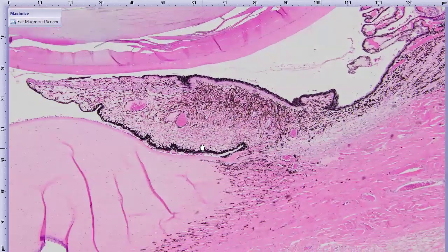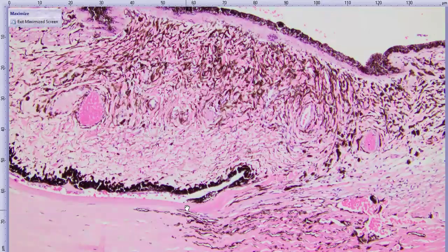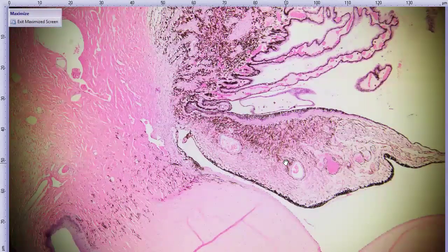When I looked at the anterior segment of this eye, I looked at the iridocorneal angle, and there's really no ciliary cleft to speak of. So we have the end of Descemet's membrane here coming right in and joining up with iridal tissue, and it's similar on the other side. And so I vaguely thought maybe this globe also suffered from iridocorneal angle malformation or anterior segment dysgenesis.